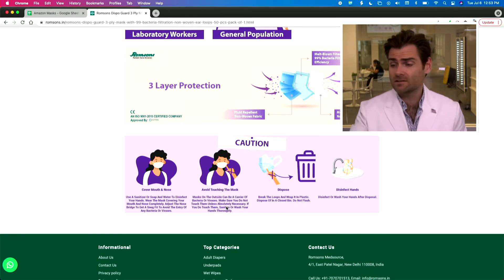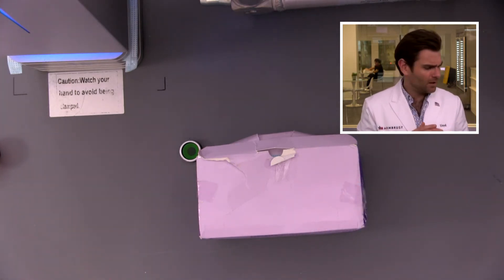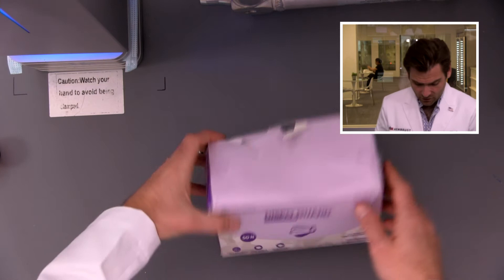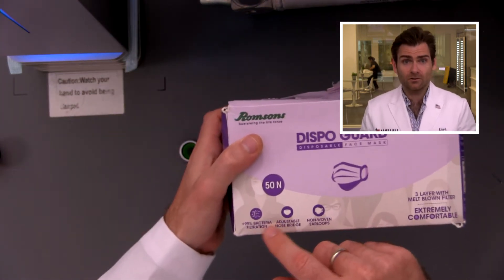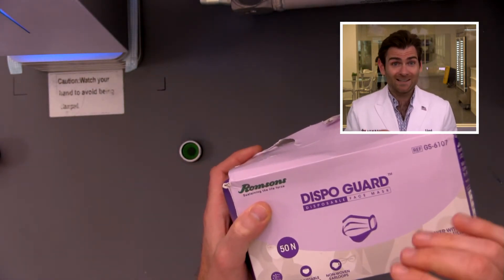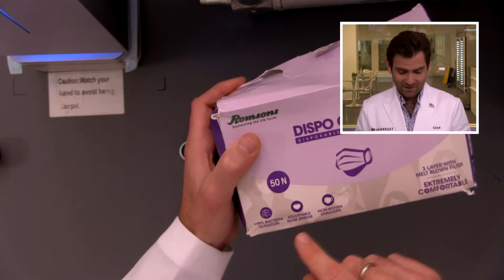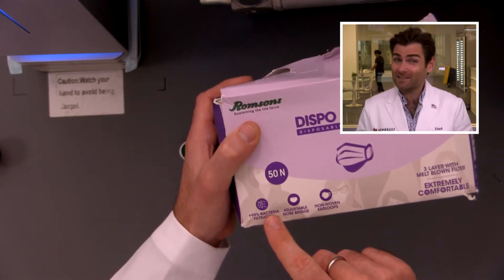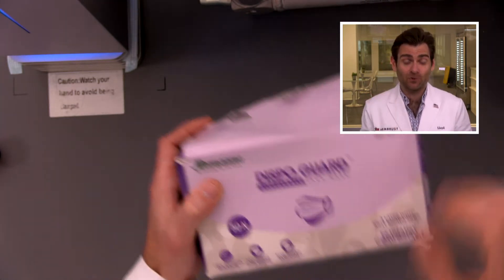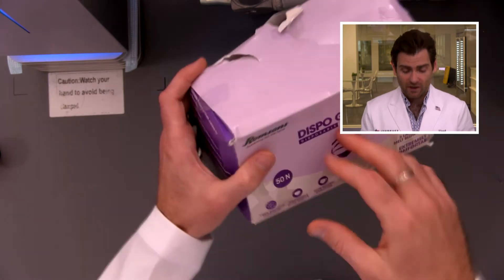The Indian standard doesn't require a PFE machine like this until you get to what's called a Class 3 Indian mask. The problem with bacteria filtration is that bacteria is way too big — bacteria is like 10 to 20 times larger than the COVID particle. So this mask is designed to protect against bacteria, not COVID. It's disingenuous to claim 99% bacterial filtration if you're selling a mask for COVID protection but only meeting a lower standard. The American standard is much higher.